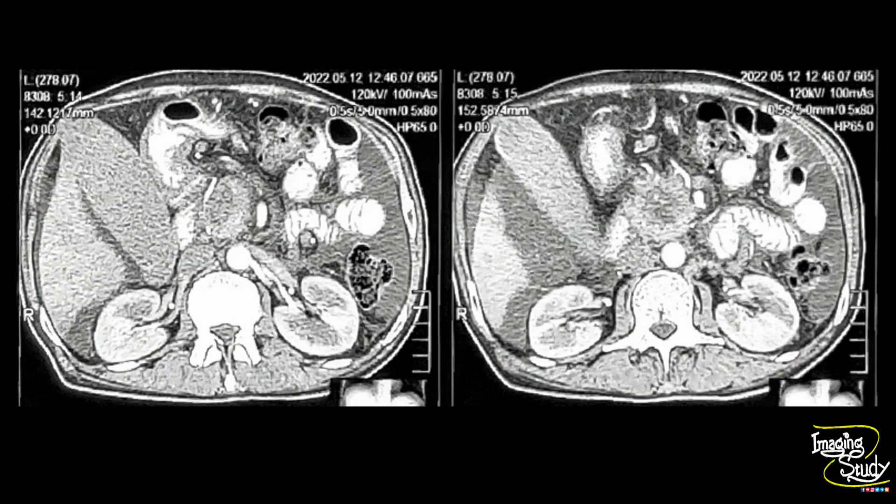Here is the CT image — poor quality — and you can see the heterogeneous lesion at the head of the pancreas.